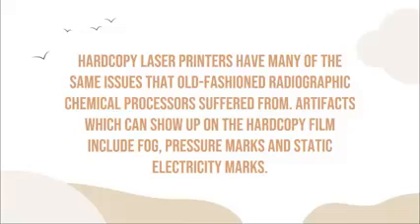Okay? So, when that happens, much better kung double-sided or double emulsion na film ang inyong gamiton. So that, dili siya makaproduce of artifacts. Unlike single-sided emulsion films na pag ma-upside down mo siya butang sa printer, it will produce artifacts.